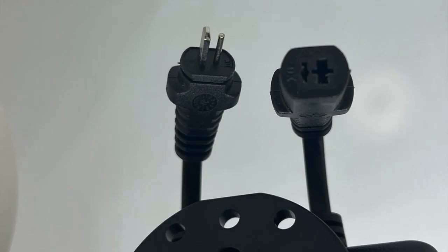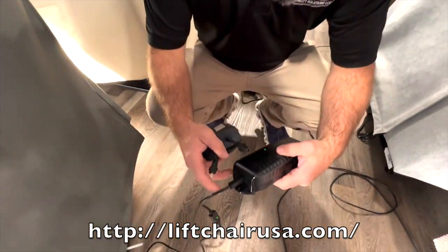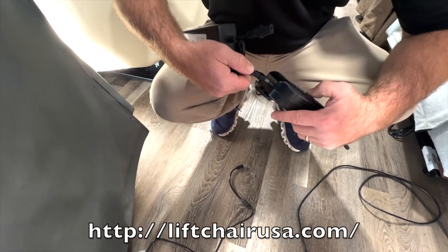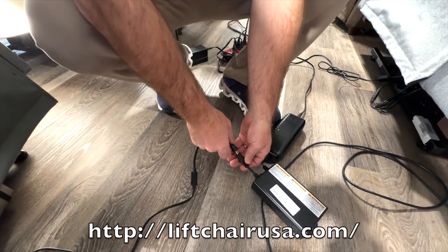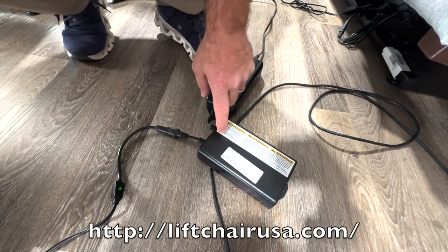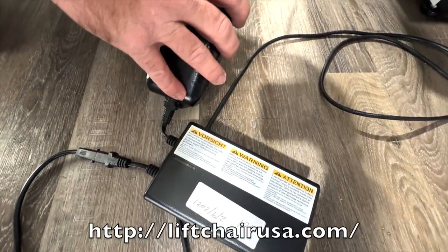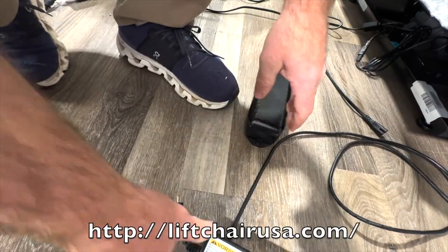Here's how it works — it's really cool. If you have any chair with a transformer, instead of buying the expensive ones from the manufacturer you can get these from us for probably around $120. It plugs into the transformer and this plugs into here, so this is always being charged when the chair is not in use. You'll see the light kick on — green means it's fully charged. So let's say the power goes out — let me unplug it from the transformer completely.